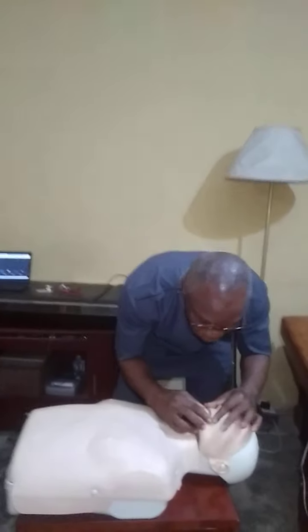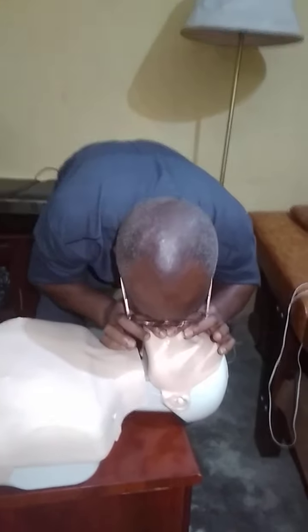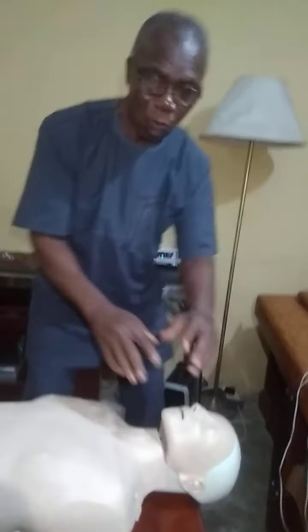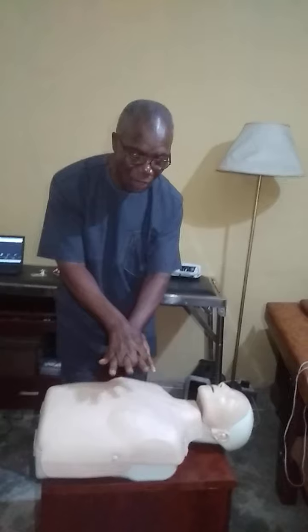Then go straight to the mouth. While I do that, I'll go back straight on. Remember, I said 30 each.